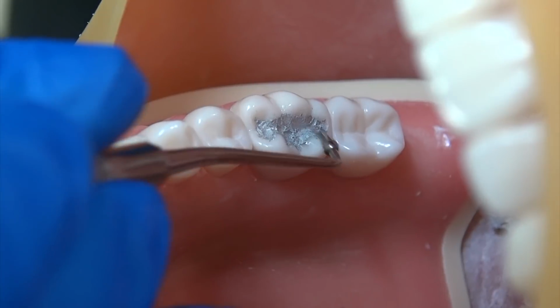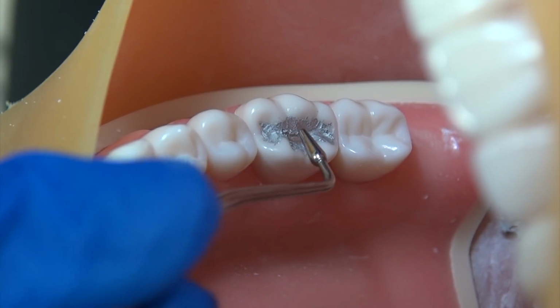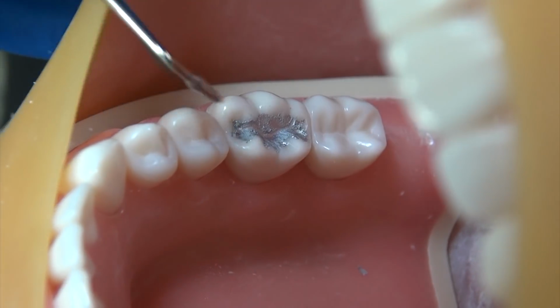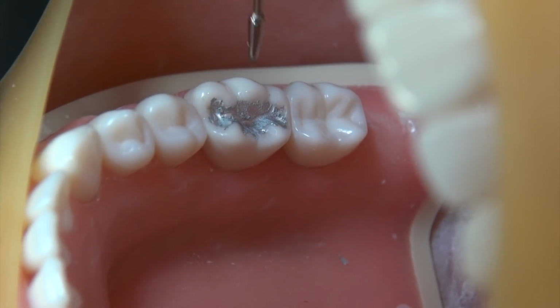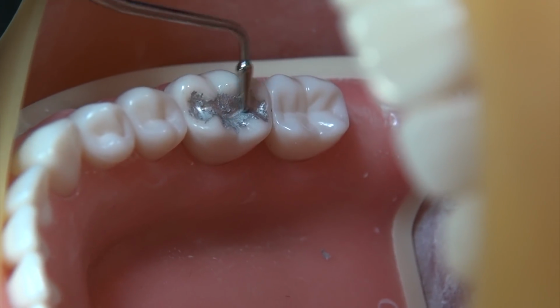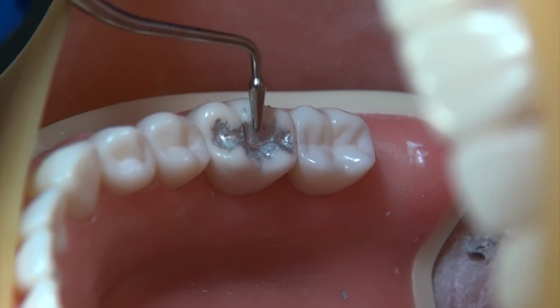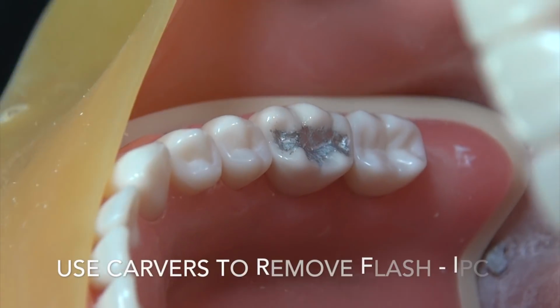Now see how with each instrument that I utilize, it's starting to get a little bit more flush, a little bit more smooth looking. The real important aspect is that you don't want to play with it too much. See how I'm following those grooves? So if you follow your natural anatomy, then it makes it easy not to get those deductions for not having the proper form. Now to remove your extra flash.